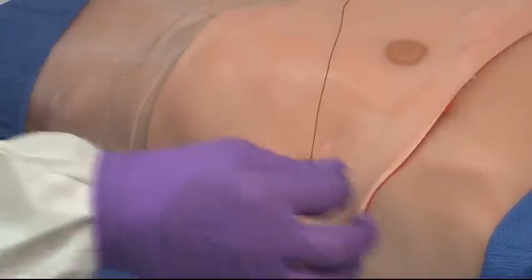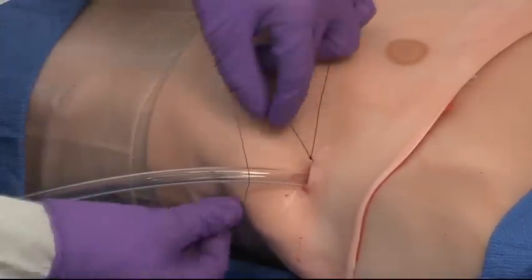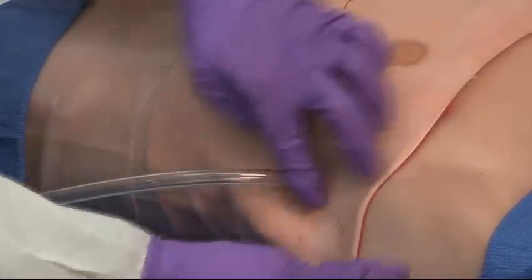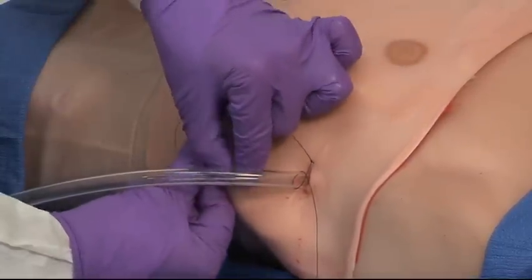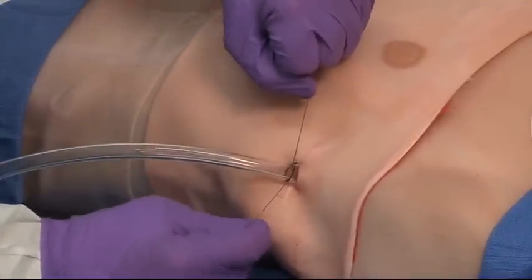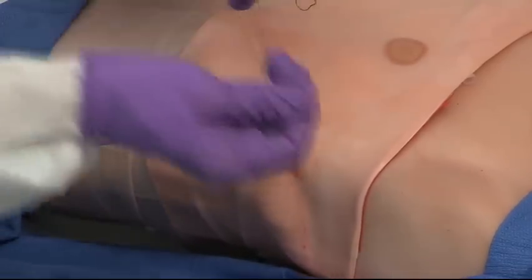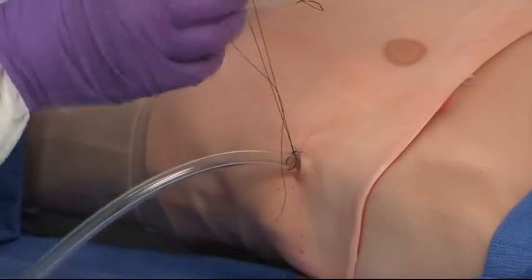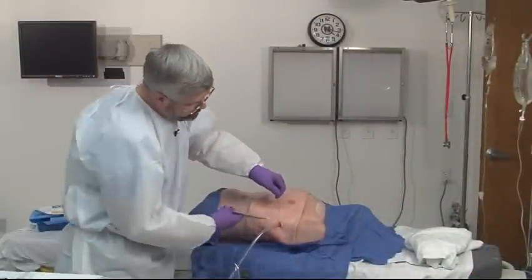And then we want to fix this firmly around the chest tube. The way I like to do this is to actually create a half hitch on one side of the tube, and then using the other suture create another half hitch, as you see, and then pull opposite on either side of those tubes so it now indents that tube. And while holding this under tension, I can now tie this down securely. And the tube is fixed to the chest wall and not likely to come out. We then cut the suture.